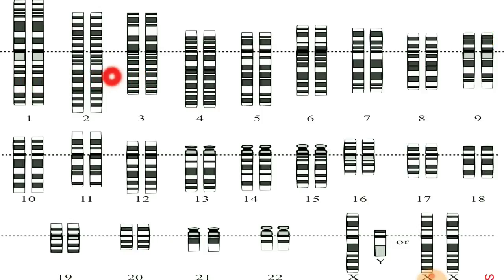And in the second group you can see chromosomes 4 and 5. These are a little shorter or smaller in size compared to 1, 2 and 3. So here again the chromosomes have the centromere of the submetacentric kind.